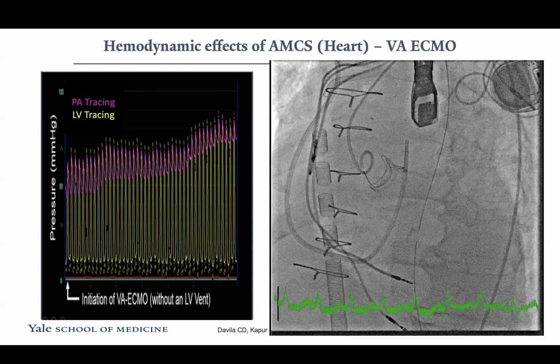I've had several patients that I've been following that all had a stroke after ECMO. Yes, but these are hypotheses. Remember, these are 4.5 liter flows, but it just seems like it is possibly one of those things.